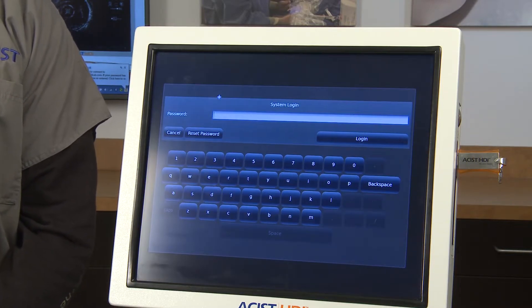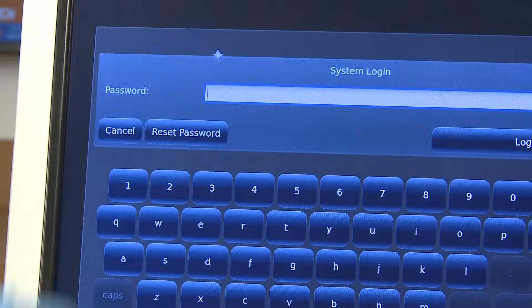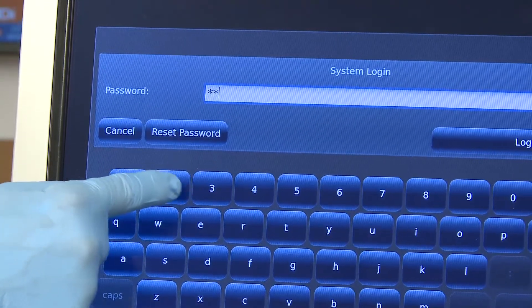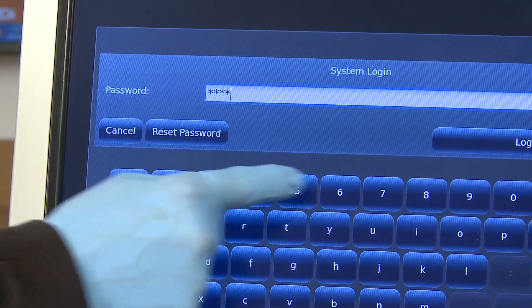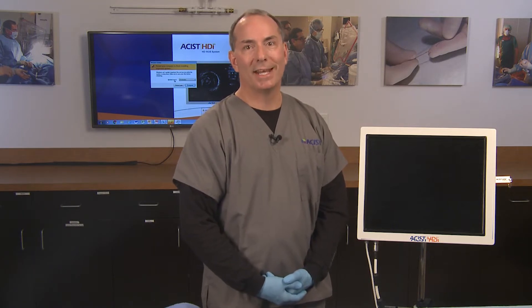Enter the system login password. A default system login password of 1, 2, 3, 4 is assigned to every console. After installation, a custom password will be created. While a new system login password can be created anytime, doing so causes all study data currently stored on the system to be permanently deleted.